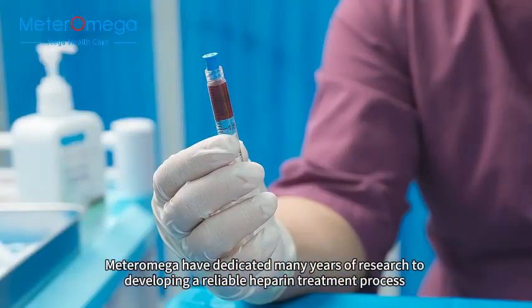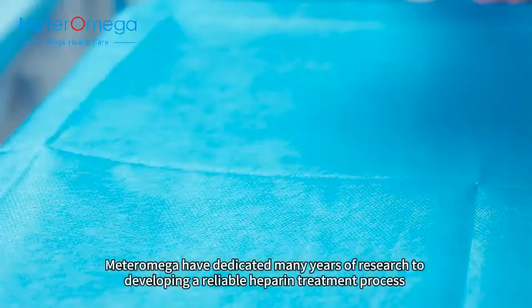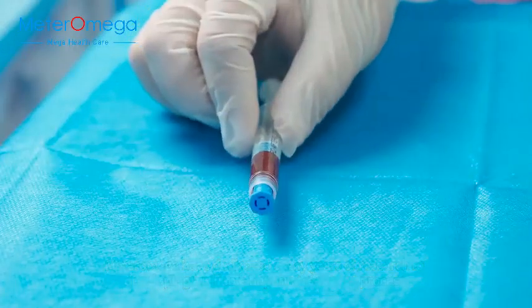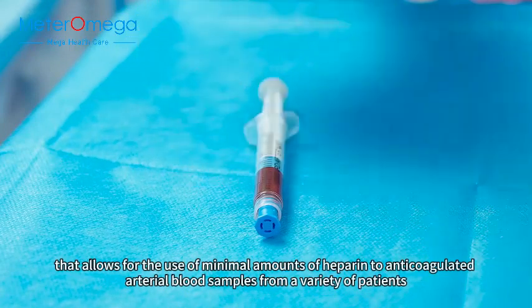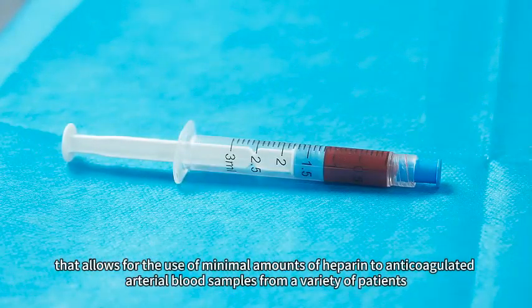Meter Omega have dedicated many years of research to developing a reliable heparin treatment process that allows for the use of minimal amounts of heparin to anticoagulate arterial blood samples from a variety of patients.